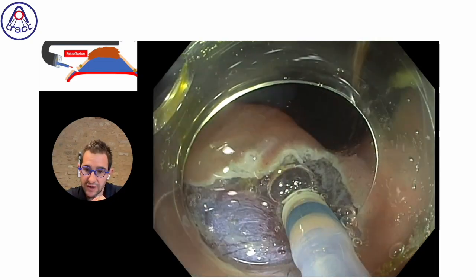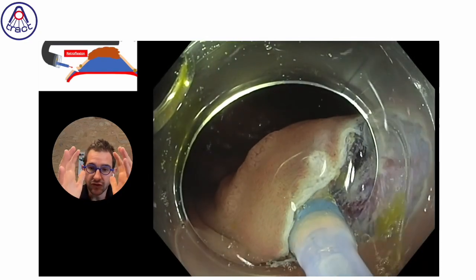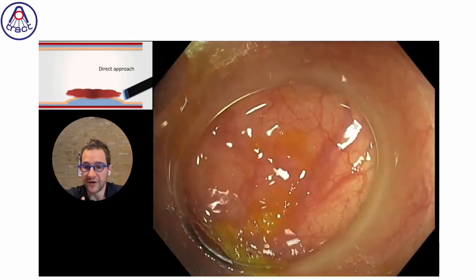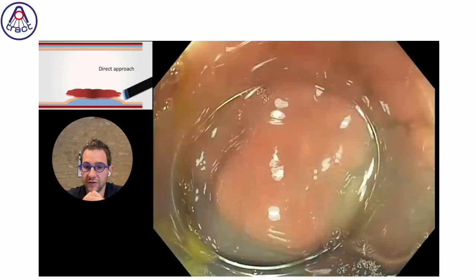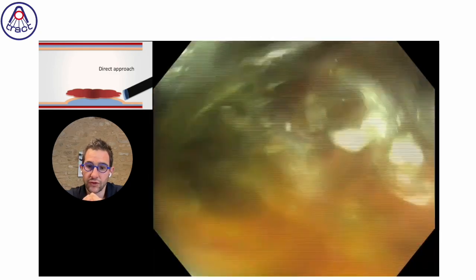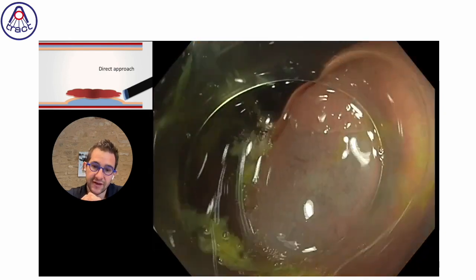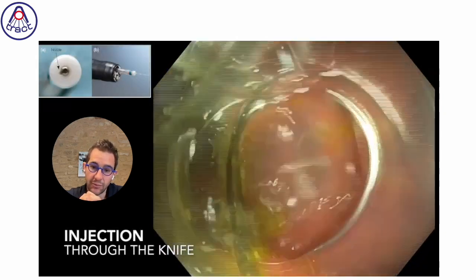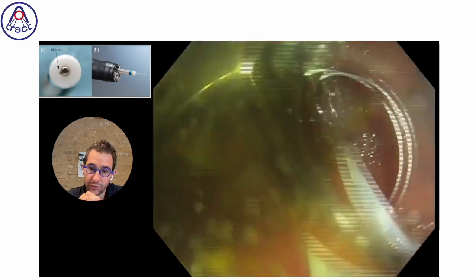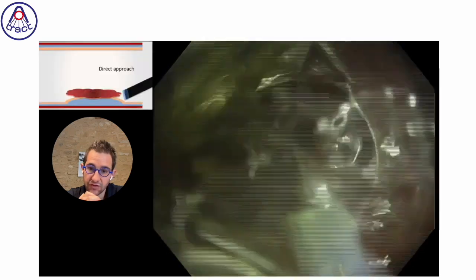So once again, please lose some minutes to do a very good trimming and a good dissection in retroflexion, and therefore you go back to a direct approach in order to do your lesion on the anal edge. In this case, we go back to the area which is already injected, do a small hole with the knife, and complete the incision thanks to the knife.